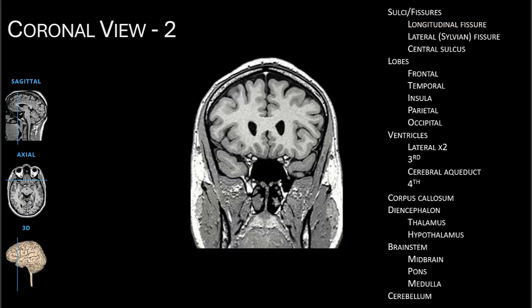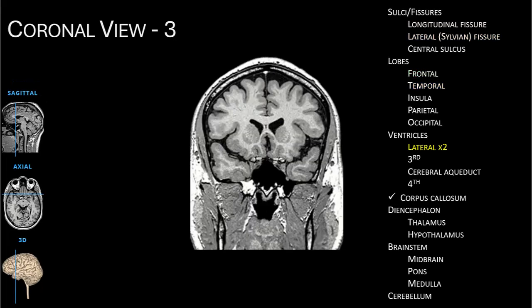Now we've shifted posteriorly slightly, as evidenced by the emergence of the lateral ventricles noted with an L. We still see the longitudinal fissure at the top, but now we see a lateral fissure separating the frontal lobe from the temporal lobe.